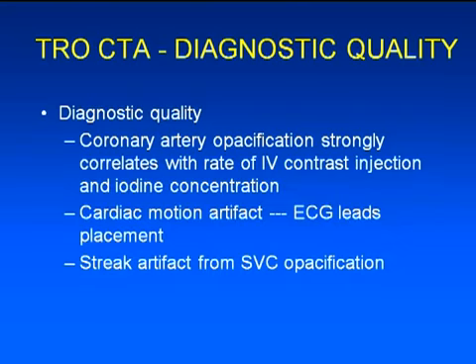Also keep an eye out for streak artifact. If you're doing a uniphasic injection and you get a lot of streak artifact that is precluding your evaluation, either for PE or for the RCA evaluation, you may want to try a biphasic or triphasic injection.